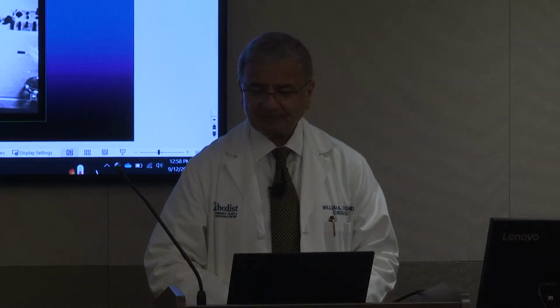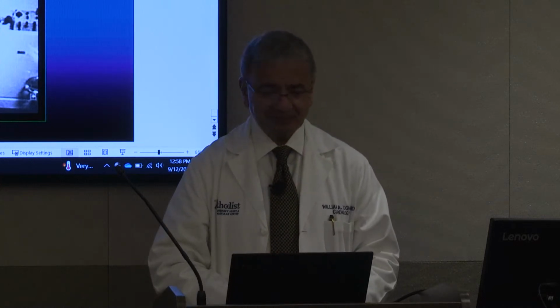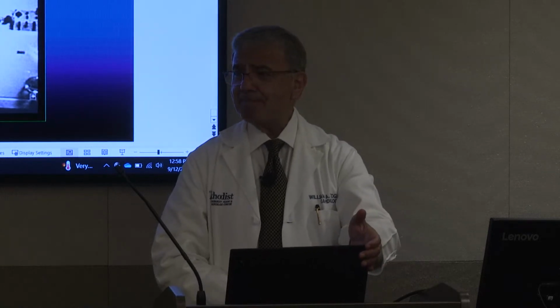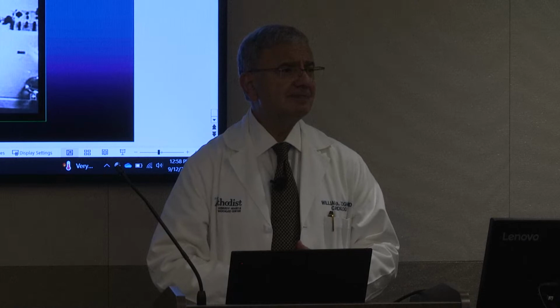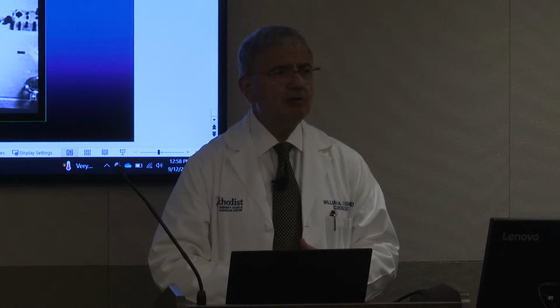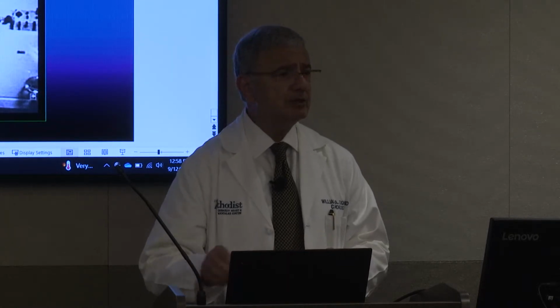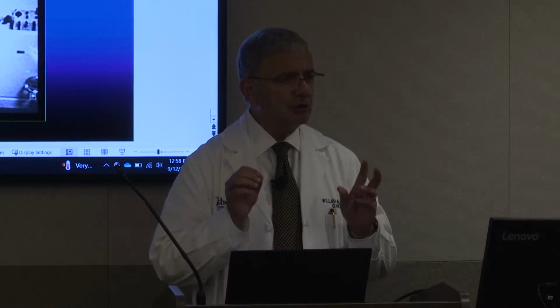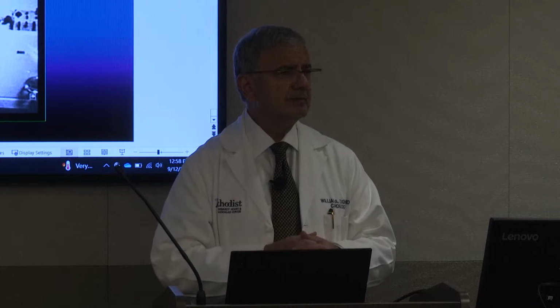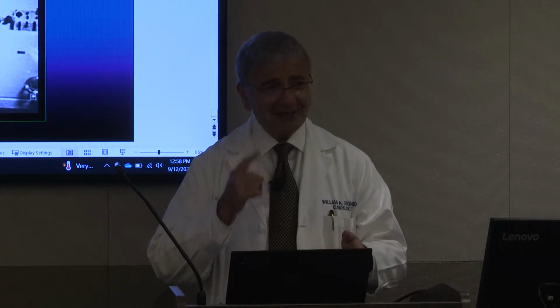Questions? No questions? Do you still use fundamental imaging? We rarely use it, although you should. The question is, do you still use fundamental imaging? If you're wondering about a structure, whether it's too thick, yes or no, you should go fundamental, high frequency. But most often, we're not, for practical reasons.